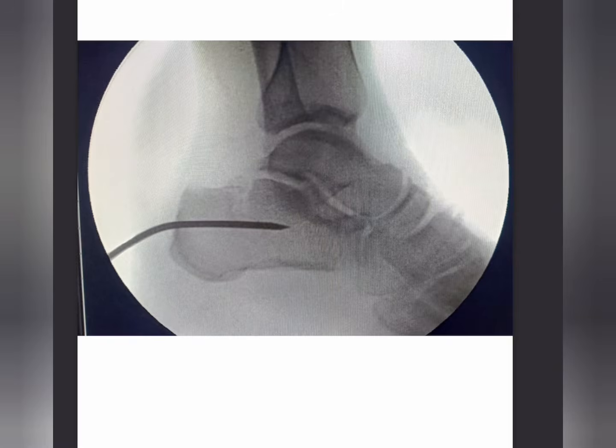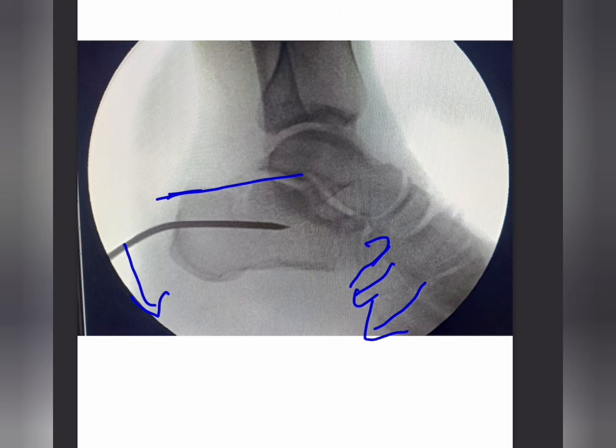Okay, and restoration of the calcaneal height along with both the angles which I described. As you can see, there is continuous plantar flexion going on, and we are pushing the pin inferiorly to get the compression and calcaneal height, to restore the calcaneal angles. Now you can see the Bohler's angle is getting restored, gradually up to 20 to 40 degrees, and the Gissane angle is also gradually becoming 120 to 140 degrees. Before it was 160 degrees and Bohler's angle was less than 5 degrees. Okay, so this is what you have to maintain.